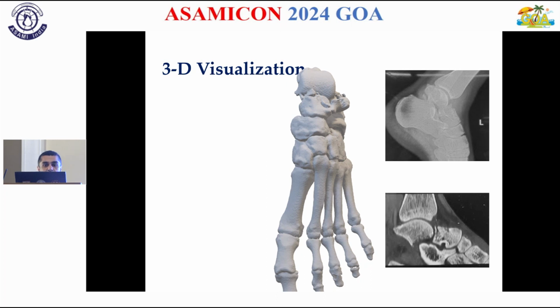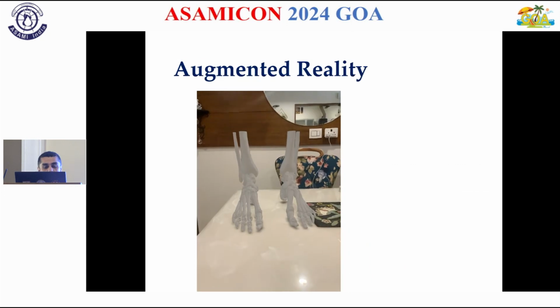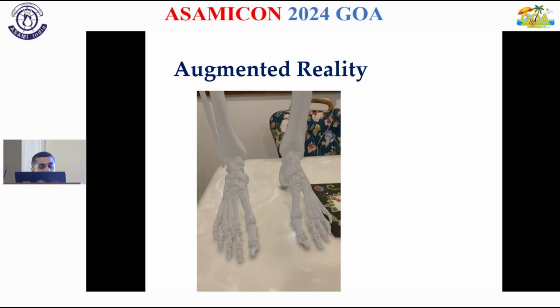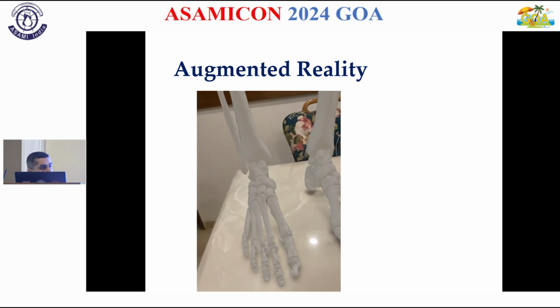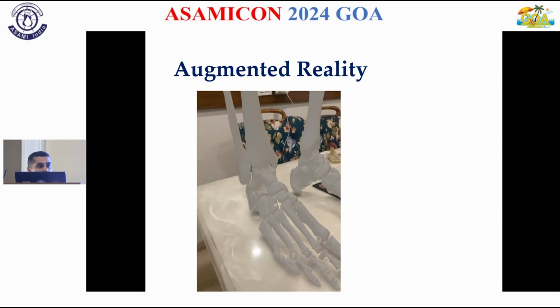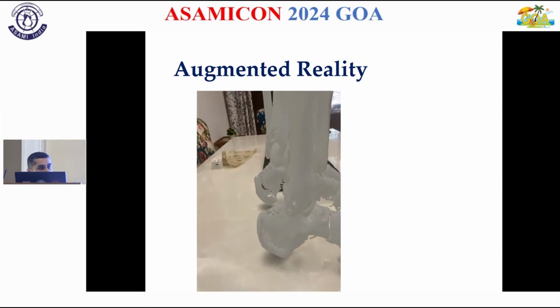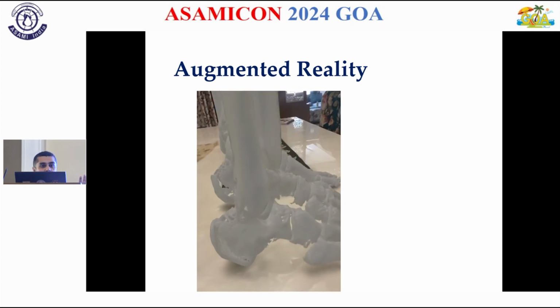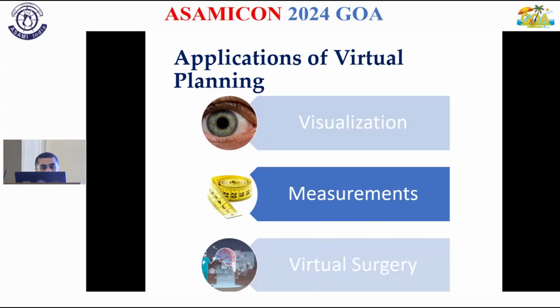Other visualization, 3D scans, we all use, so I'm not going to go into that. We have all seen it. But a very interesting thing coming up is augmented reality. So I recorded this small video with my iPad. You can have models, project them onto your table, and you can even have markings for your screws. So in the OR, you can project this onto the patient's leg and then have this as a rough guide for trajectories of screws or wires or what have you.